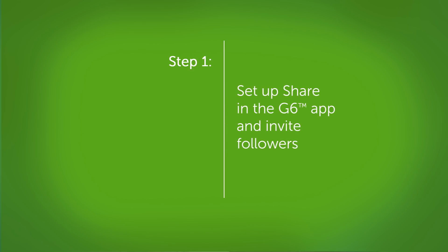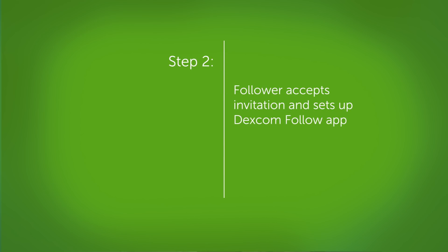To set up Dexcom Share and Follow, first set up Share on your G6 app and invite a follower. Second, the follower accepts the invitation email and sets up the Dexcom Follow app. To set up Dexcom Share, simply press the share icon on the Dexcom G6 home screen and follow the instructions.